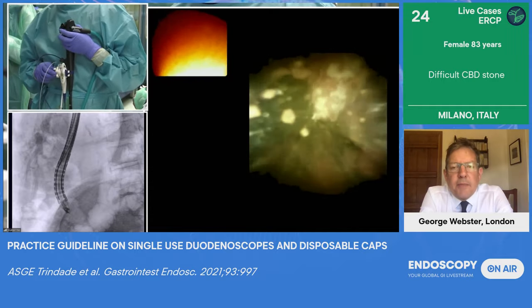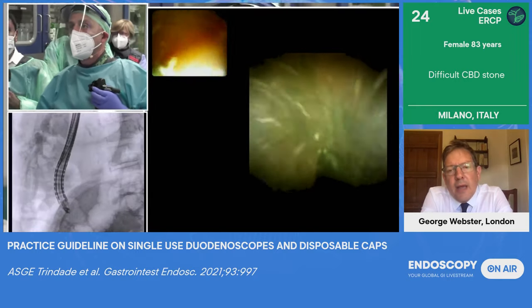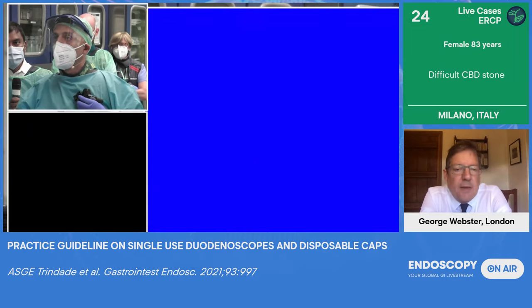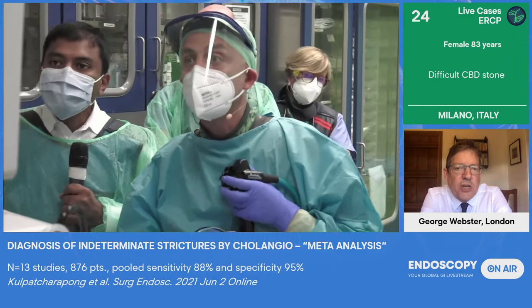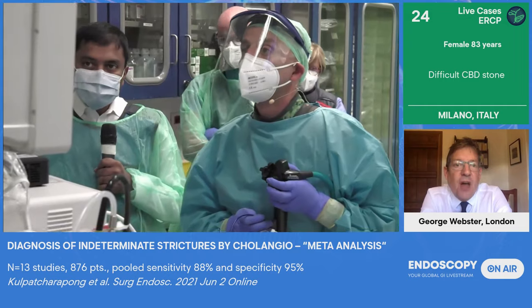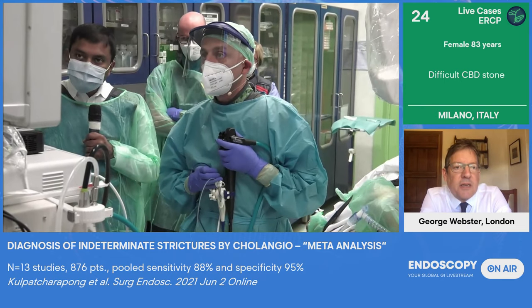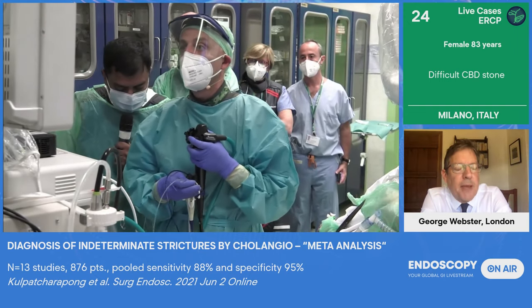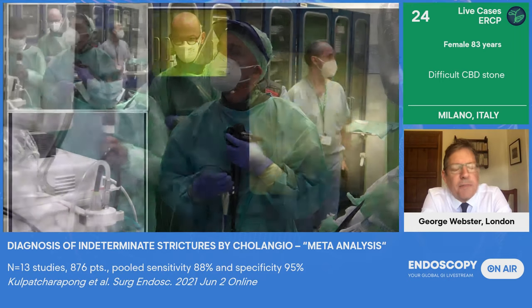Andrea, lovely demonstration of using the combination of the Exalt single-use duodenoscope with the SpyScope. Can I ask yourself and maybe Shyam about case selection? SpyGlass is not available in every hospital. And certainly we find in London that the vast majority of patients referred to us with difficult stones have already had at least one, sometimes three, four, five conventional ERCPs. And it was really obvious from the pre-procedure imaging that conventional ERCP was never going to finish the job. Are there criteria that you feel should lead to patients being referred before any sort of conventional ERCP? In other words, straight for SpyGlass.